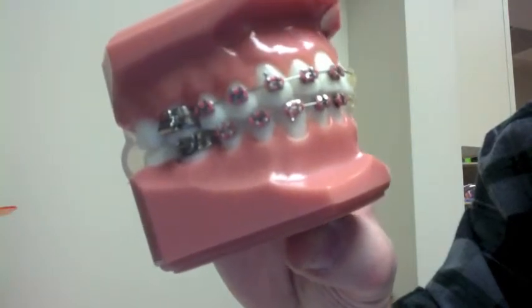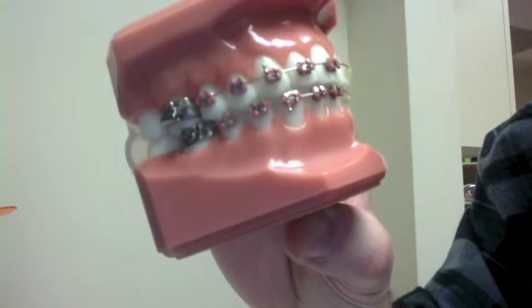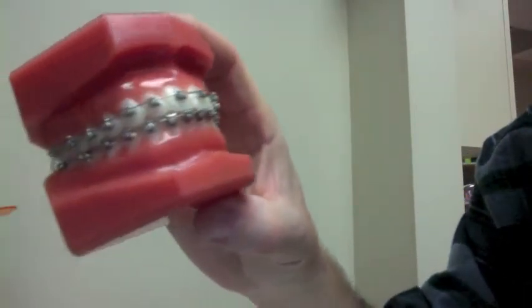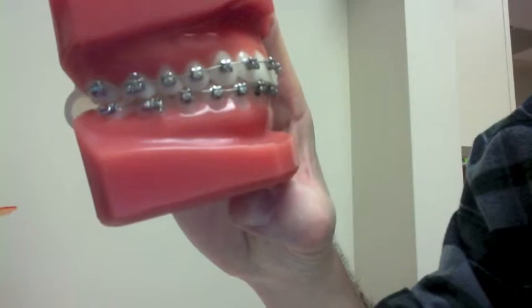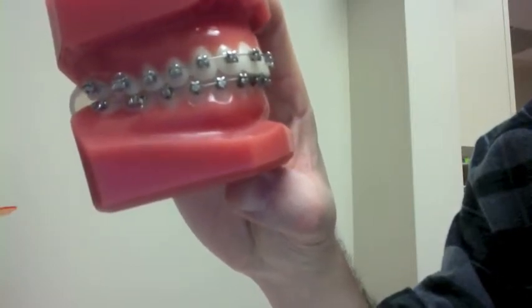The kids like the color ties because every time they came in they could pick different colors. But about 10 years ago I stopped using this color tie method in favor of a more modern appliance known as the Damon System that looks like this. And if you look closely, you'll notice there's no more rubber ties. Every bracket just has a door that opens and closes, and that's how the wire is held in place.